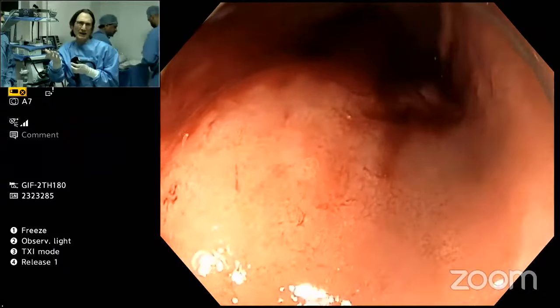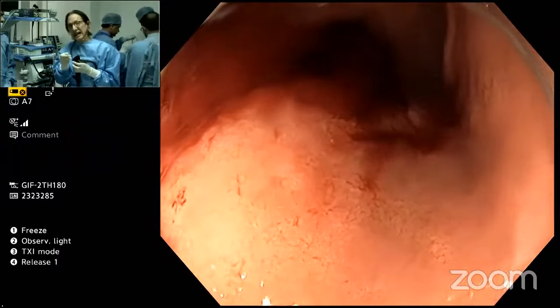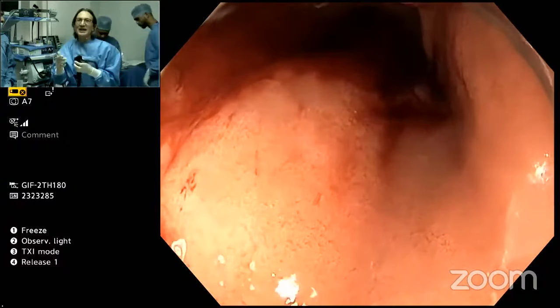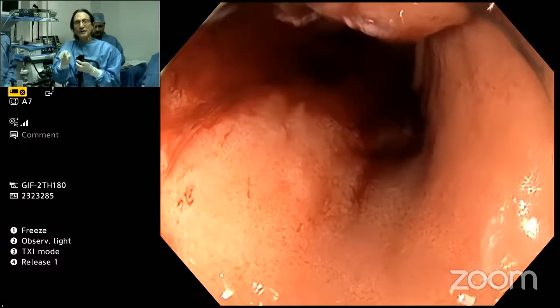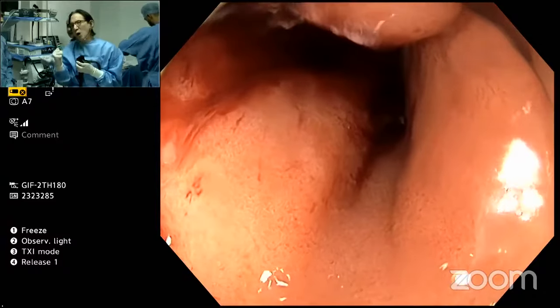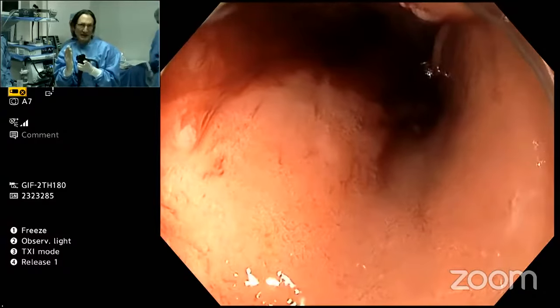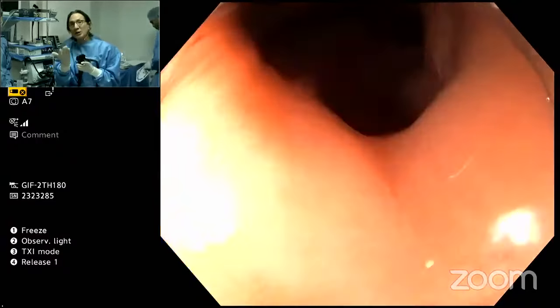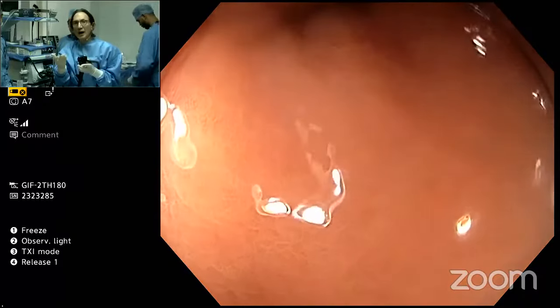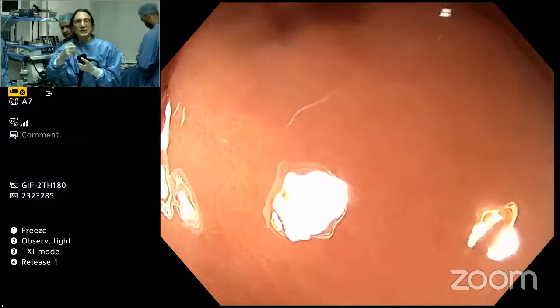just with a snare. You don't have to actually dig something into it. But the helix anchor was designed by me with this thought: I want to be able to remove stromal cell tumors, cysts and leiomyomas, and I want to invert the wall. And then I can get a serosa to serosa apposition. And then I can either let it just slough off and enucleate, like yesterday you saw, and first I would do a cruciate incision to facilitate the enucleation.